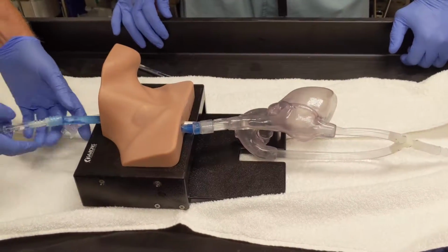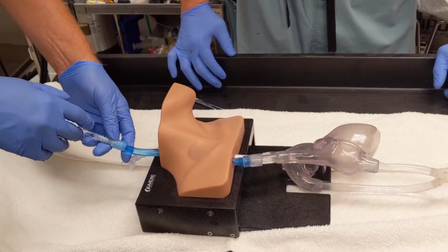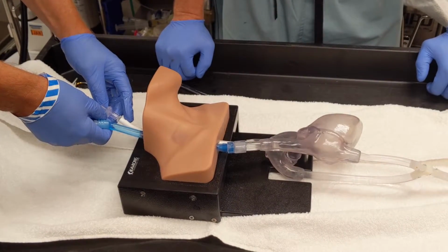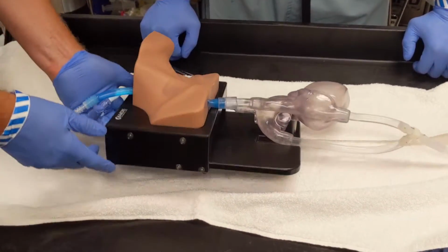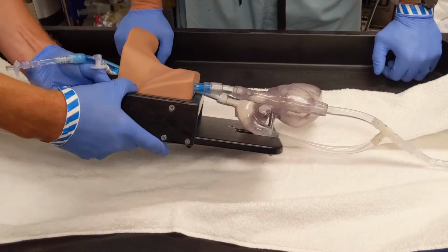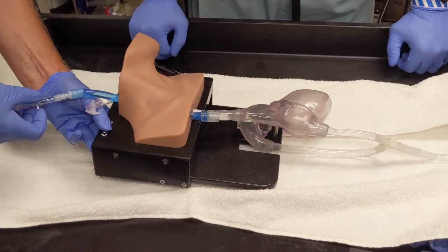So to prime it, you open these stopcocks. The IJ is the side that is the slowest to prime. So usually you can close the stopcock on the carotid first. The bubble will end up here. You can do a gentle squeeze on the bag and rotate, and then leave this open. As long as you're not flipping it over, this will stay intact, and it'll let the air come out. And then you close it up. But you do need a chux or a couple towels to catch it.